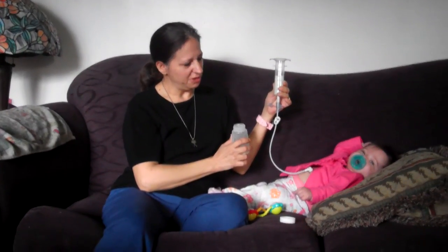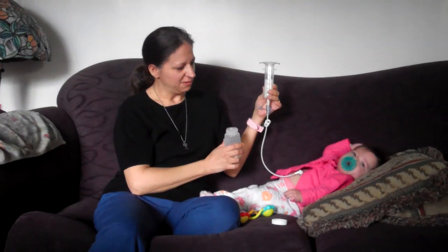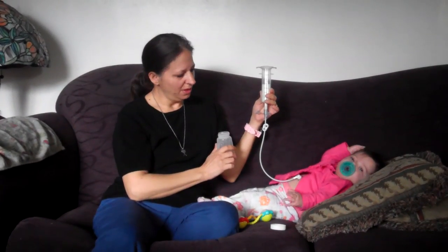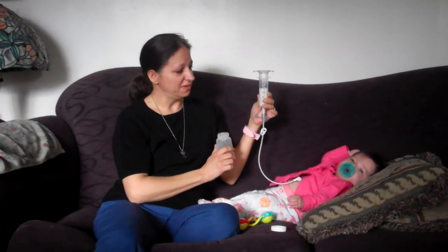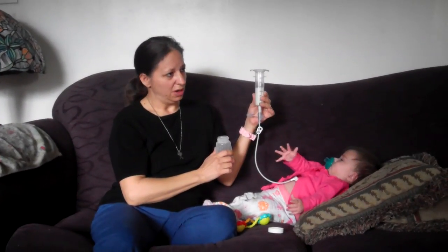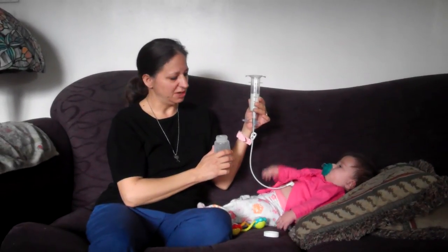And so with Hannah, we don't want to lay her flat on her back. We want to keep her more upright. So in her bed, we would have it elevated a little bit. Now there is a machine you can use at night that will automatically pump drips into her belly. You set the speed, how much she gets, and that.